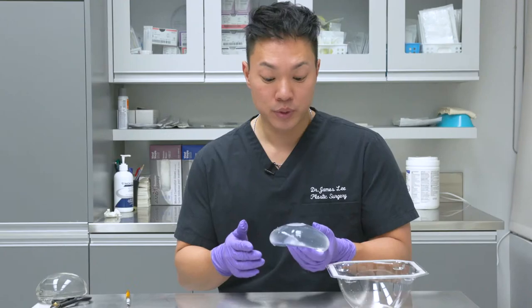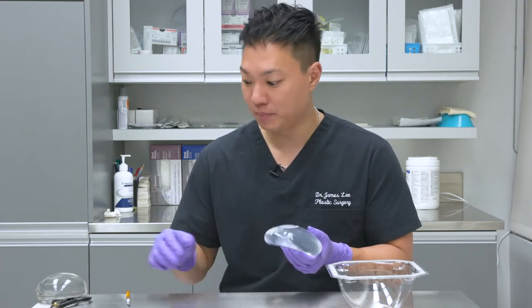Hi, my name is Dr. James Lee. I'm a board certified plastic surgeon. Here we're going to demonstrate what happens to a ruptured saline implant.